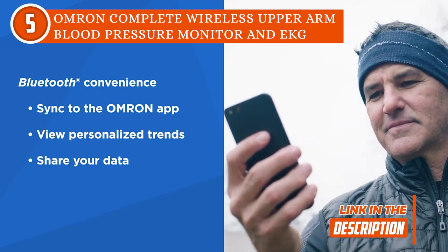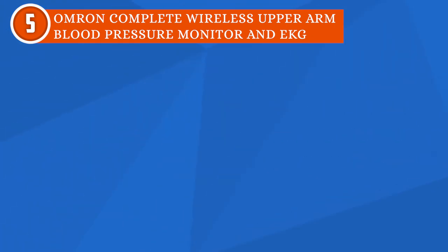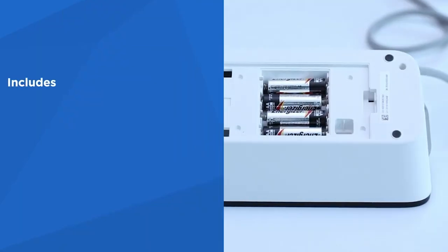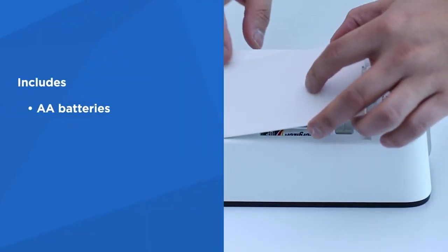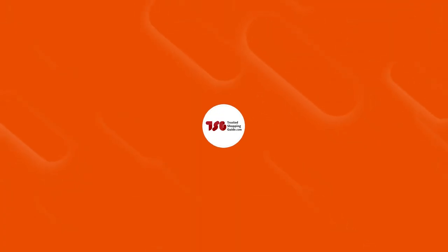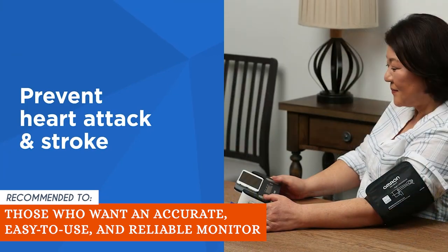The blood pressure and pulse rate are displayed on the monitor, and the reading is transferred to the smartphone as soon as the blood pressure measurement is finished. Keep in mind, though, that you should only use the arm cuff, batteries, and accessories that come with it, as using incompatible ones could damage it in the long run. The Trusted Shopping Guide team recommends this to those who want an accurate, easy-to-use, and reliable monitor.